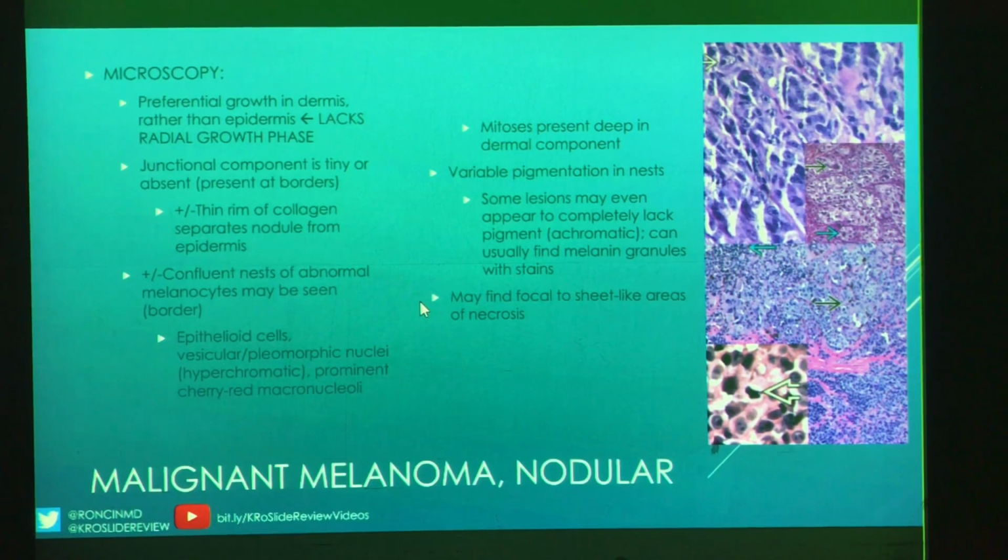There may or may not be a thin rim of collagen that's separating the nodule from the epidermis. It was really difficult to tell in our case. There wasn't a lot of epidermis, and then what constitutes the rim or not. But again, you don't have to see that.